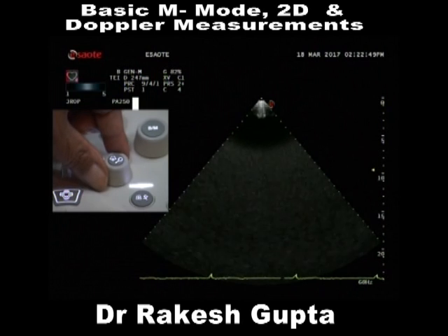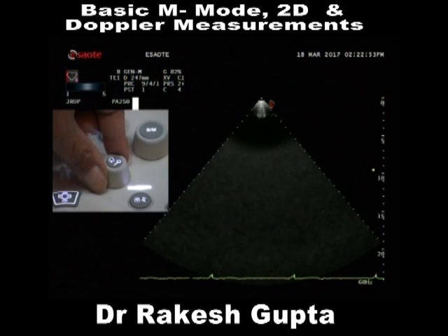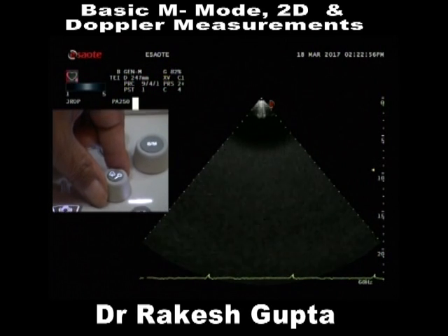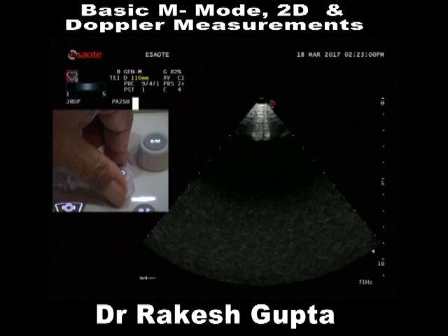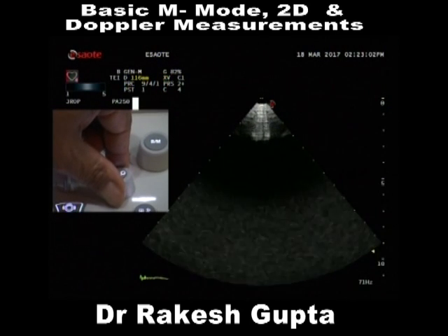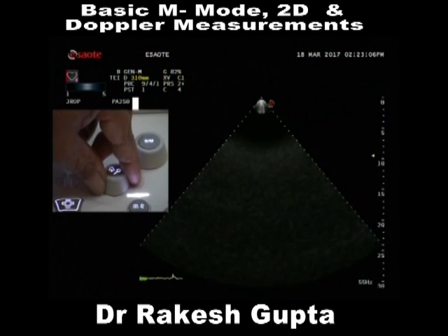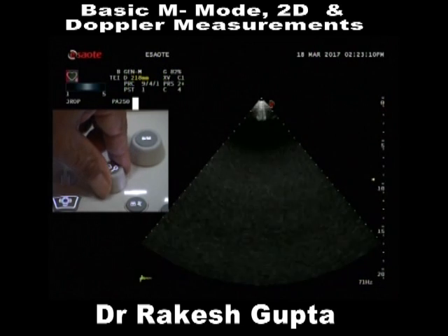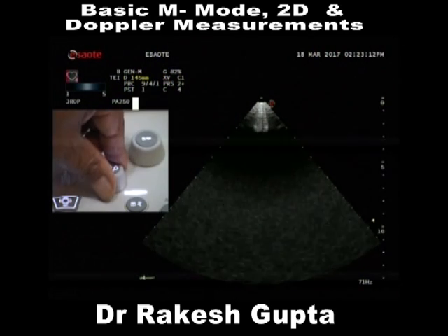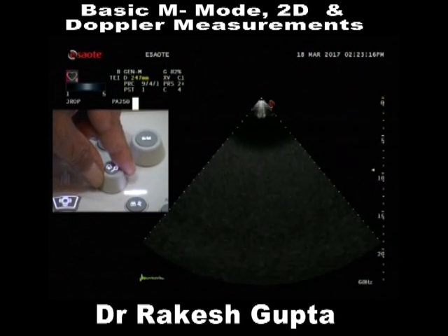So what will happen if I need a big penetration, a huge chest wall patient? I need a depth to look at his heart. And suppose I need a child or a neonate, I don't need that depth, so my depth is reduced. Here the depth is increased. So for a thick chest wall patient, we need a bigger depth. For a thin chest wall person, we need a smaller depth. So this knob, left and right, will increase or decrease the depth for a patient. Clear?